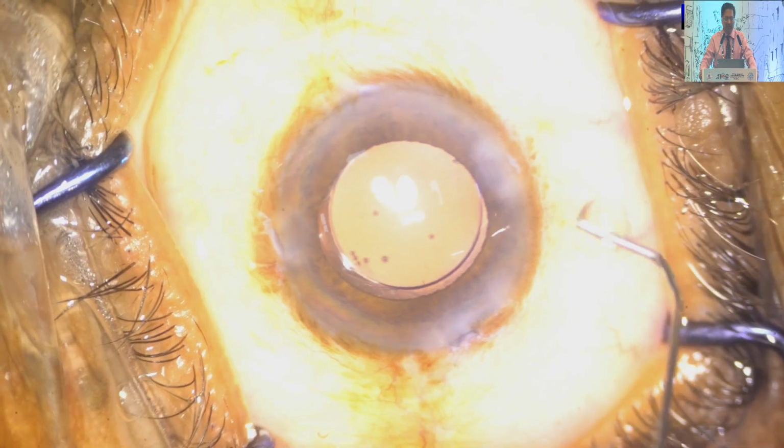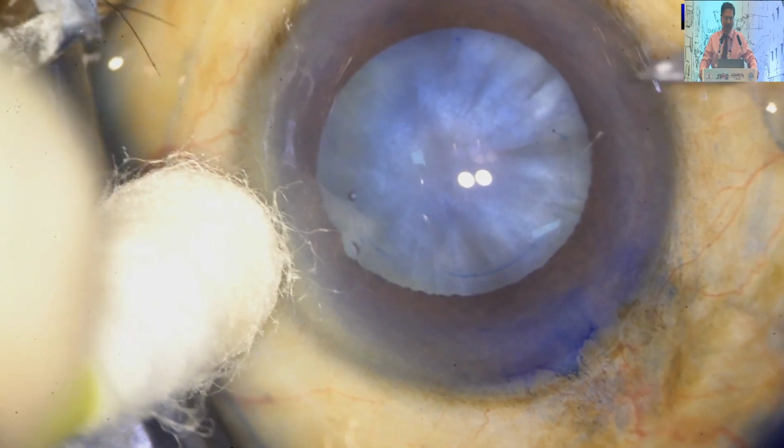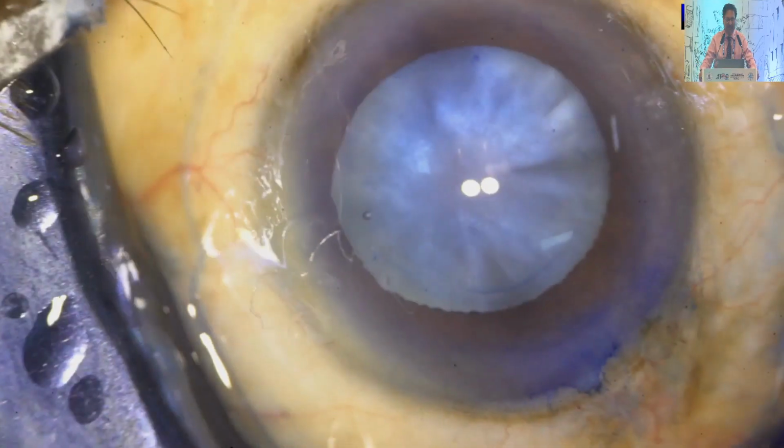So in young people, most of the time it is a soft cataract. This is another case, again 2 simultaneous incisions.